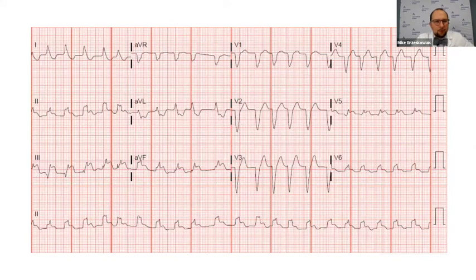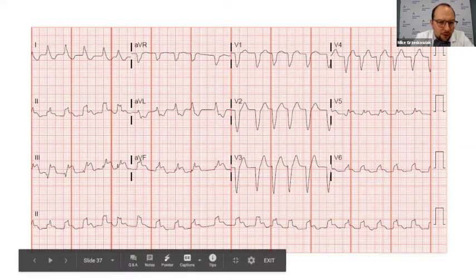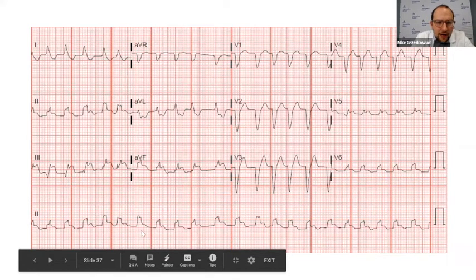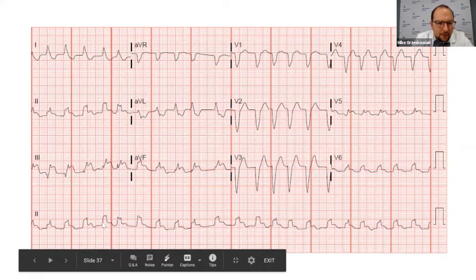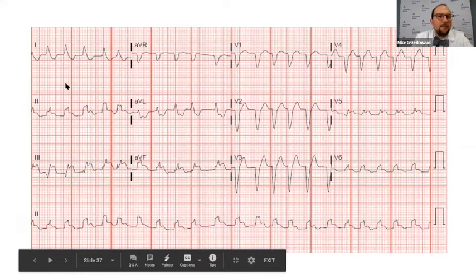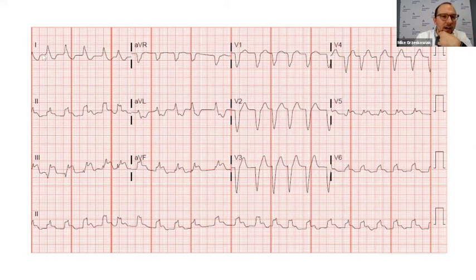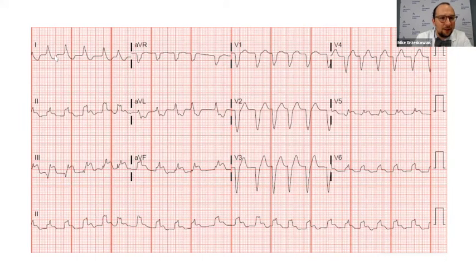Let's look at an example. Using our system — rate, rhythm, ischemia — the rate looks a little tachycardic, maybe around 100 beats per minute. It looks a little irregular, we don't really see P waves, so maybe this is atrial fibrillation. Looking at ischemia top to bottom, left to right, starting here we have some ST depressions and T-wave inversions.